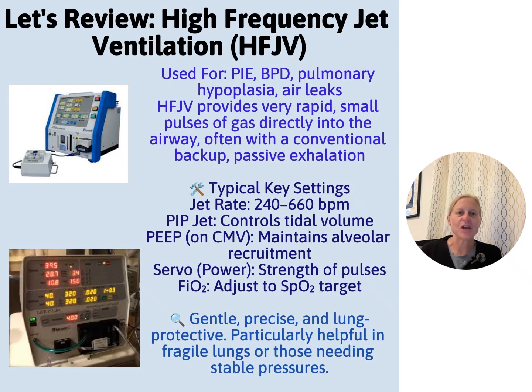So let's get to our jet. Our jet is the newest ventilator to me. I've used it for 7 years, but it's newer to me. There are two out there now, and they have the 204 now. Those are just two different pictures. I see this primarily used either as a primary mode of ventilation on extremely low birth weight babies, or for those babies with PIE, pulmonary hypoplasia, or air leaks. Again, we are delivering rapid, small pulses of air directly into the airway.